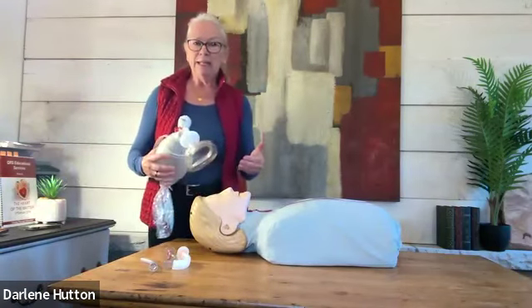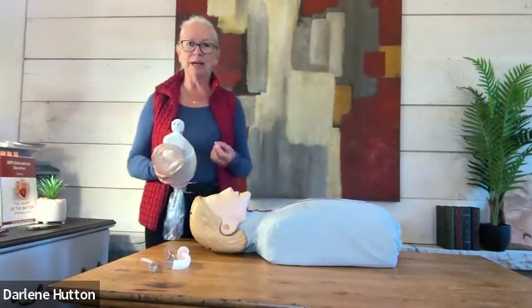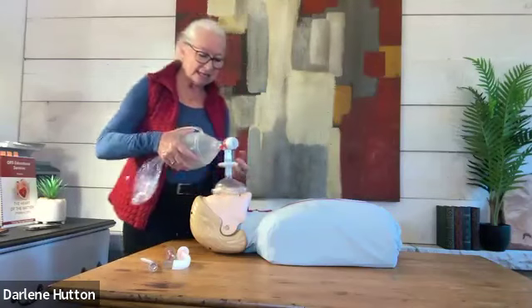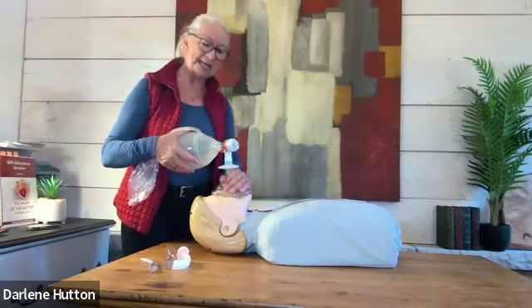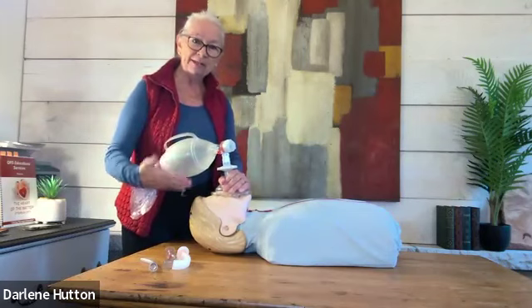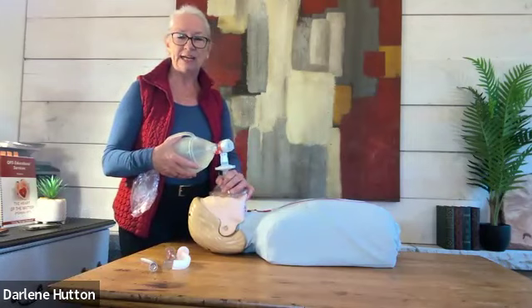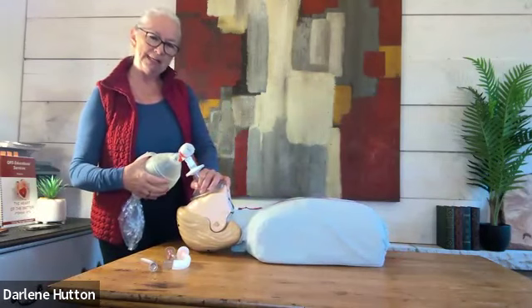If you're getting air leak, let's say you've got tiny hands, arthritic hands, there's a variety of reasons why the C technique may not work. Another alternative that I teach that is very helpful is a technique that is not your first go-to technique. So always try with the C technique, but with this one you take your whole hand, put it right on the mask and push it down. You can clearly see now, though, that I have obstructed the airway. So as a reminder, take that little pinky, put it underneath to do a head tilt chin lift. And that might get you a much better seal.